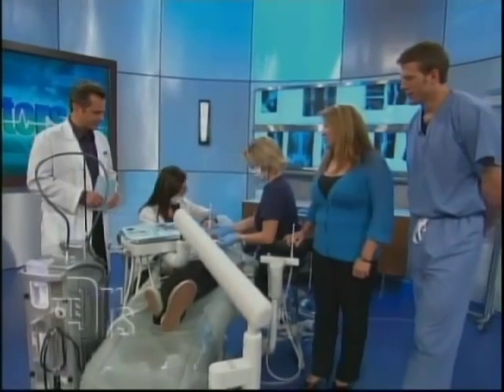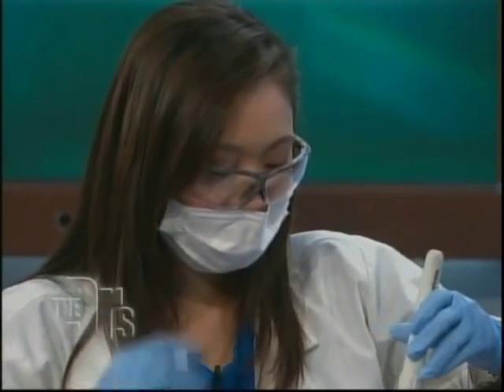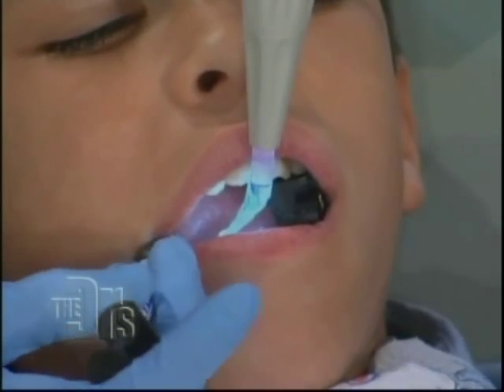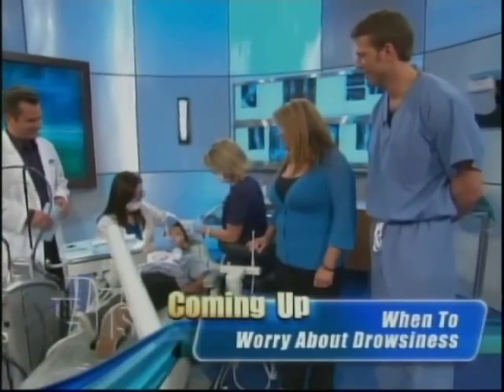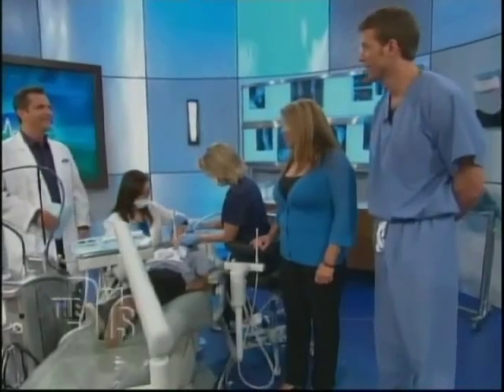Are most dentists' offices going to have this Water Lase, or is it still pretty new? A dentist has to be well-trained in order to use it. In dentistry, we want to be on the cutting edge of technology. Is there any solution for the sore jaw when you have your mouth open for so long? That's why we're using a tooth pillow — the tooth pillow kind of cushions how long you're open. But luckily, with the laser filling, it's really quick.